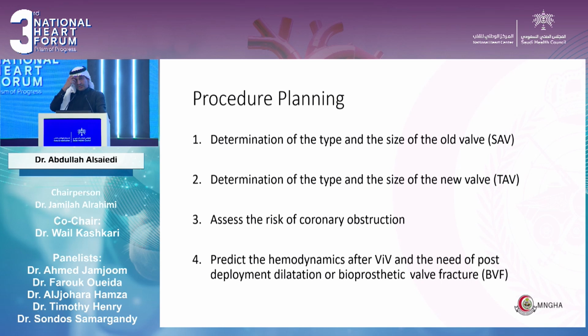Now, regarding the procedure planning, there are four items you have to remember. First of all, determination of the type and the size of the old valve. Second, determination of the type and the size of the new valve, which talks about TAVR here.